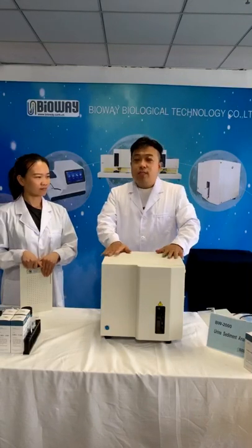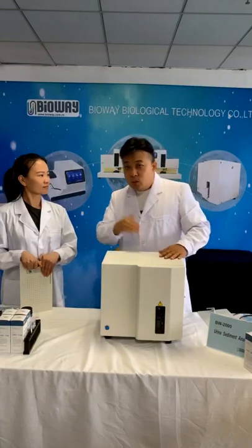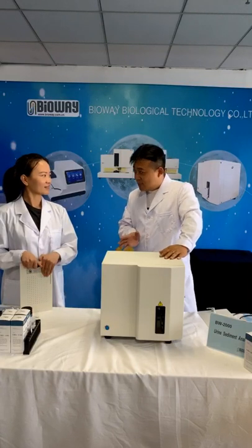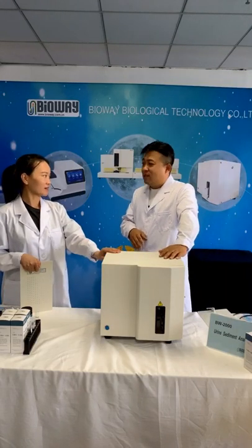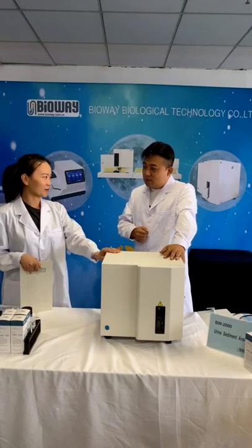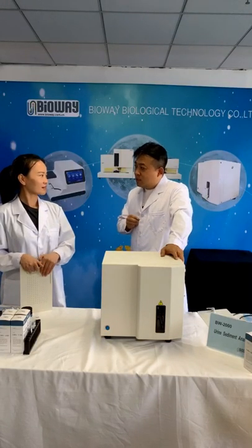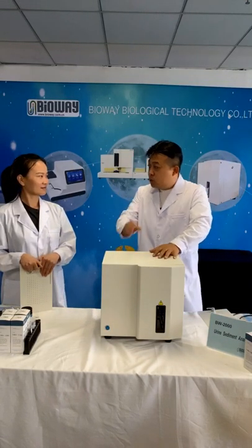So sometimes this is very important for the distributor, because if any distributor wants to introduce the products to their doctor or to the hospital or to the end user, it is very complex to explain. How can you prove the machine is correct? How can this one prove the result is correct? How can you prove that? It's quality control. Quality control means just to prove the machine is very stable for using. Understand me? Yes. So sometimes you need quality control to get the final result.